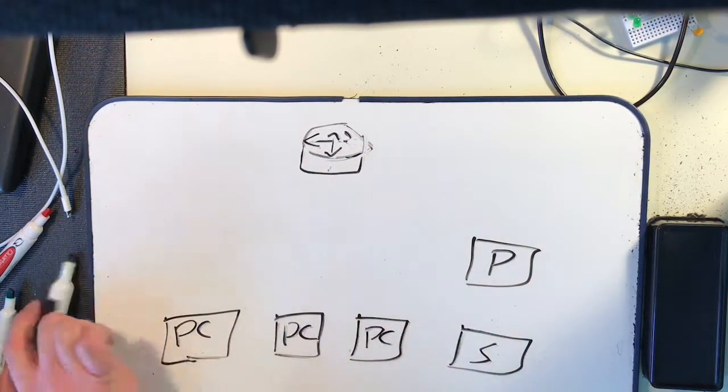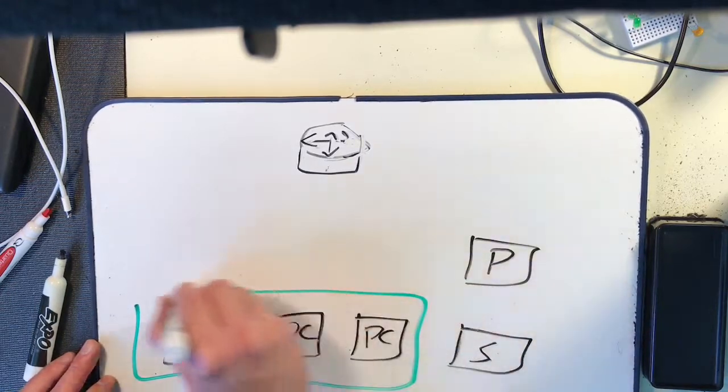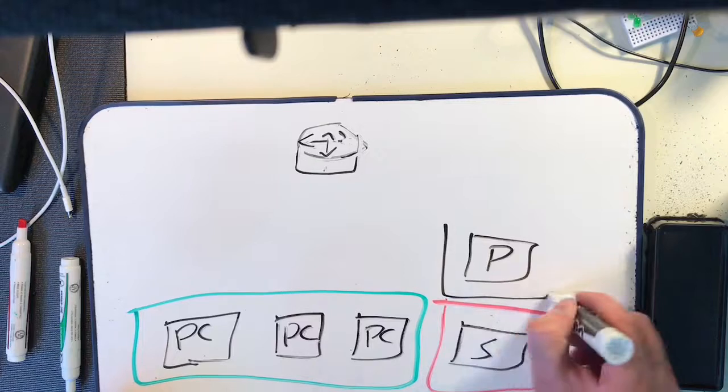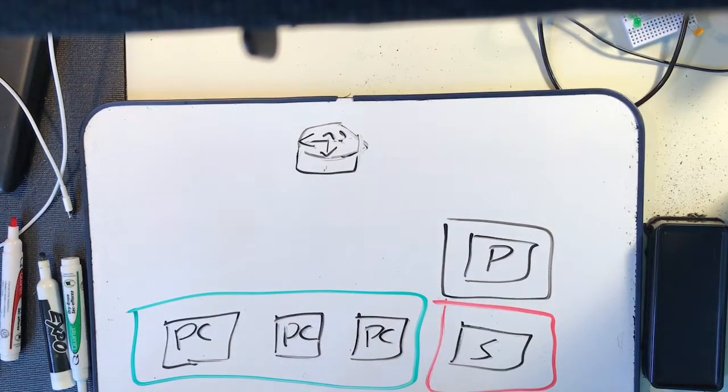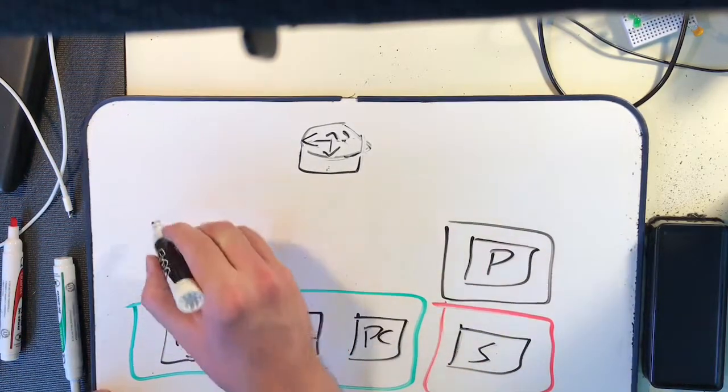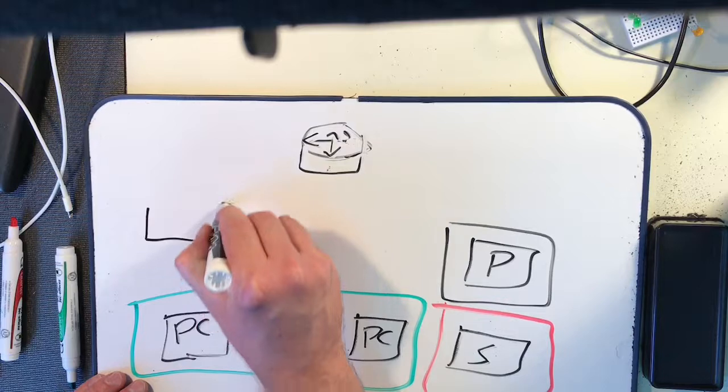Now, same thing as before, these are now on their own networks. So you want to be able to control where that traffic is going to and coming from. So in this case, instead of connecting them all to the same switch and just messing things up, we would need to have three different switches.